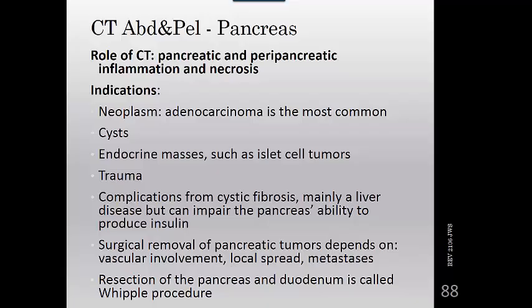And also, a lot of times, if you have dosed this patient and you've been waiting for a couple of hours and you scan them, all the contrast is out, and there's a question, you can give them a little bit more. And normally we do anyway right before we scan them, but if the pancreas and pancreatic duct are known, then you want to use the low attenuation oral water before you scan them. But if this is just a routine abdomen, normally you'll give them a little dose before you scan them. It's been 2 hours, so it's probably washed out of the area, the duodenum and all of that.